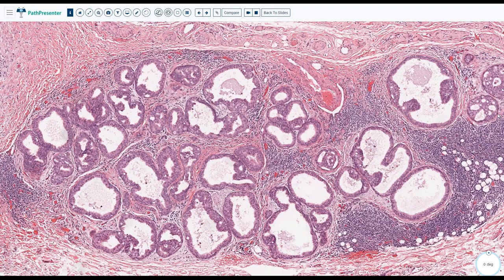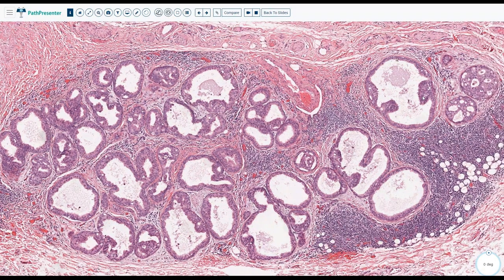Salivary duct carcinoma is inherently high grade. When you hear it, it's like high grade ductal carcinoma. For the clinician it will be, oh, this is high grade, and this is something that you always have to emphasize. This is a high grade carcinoma.